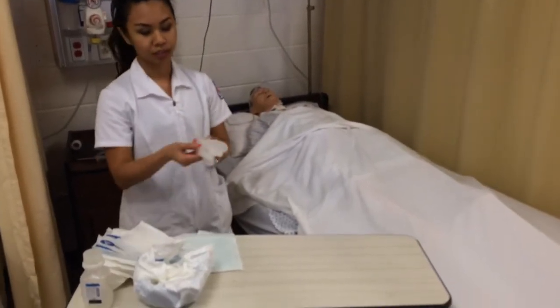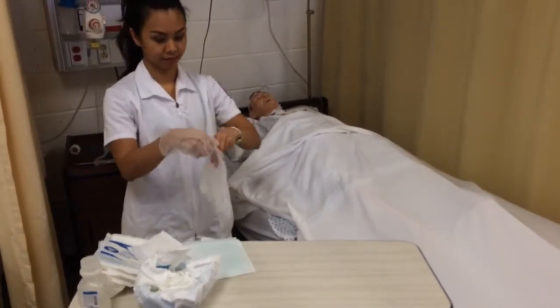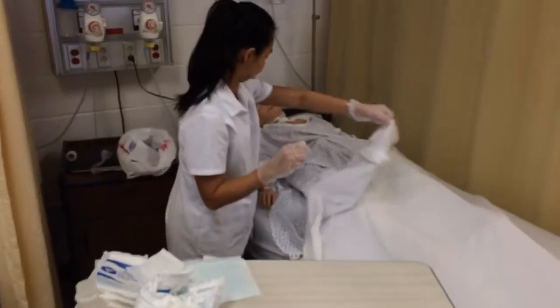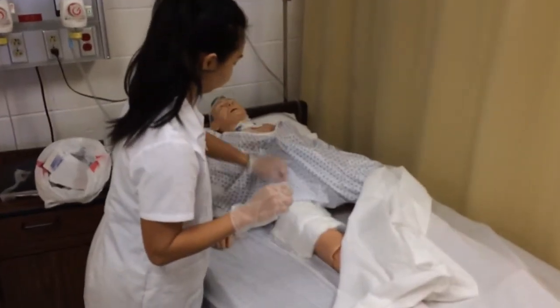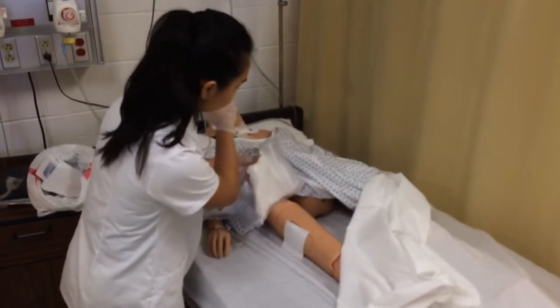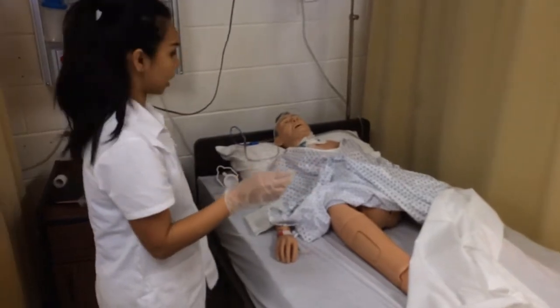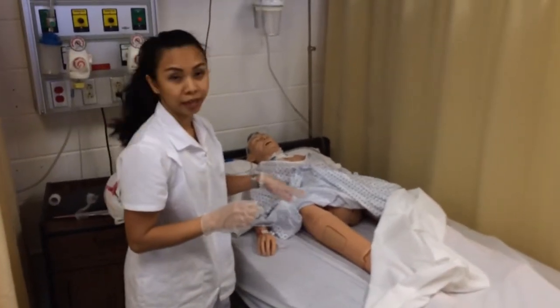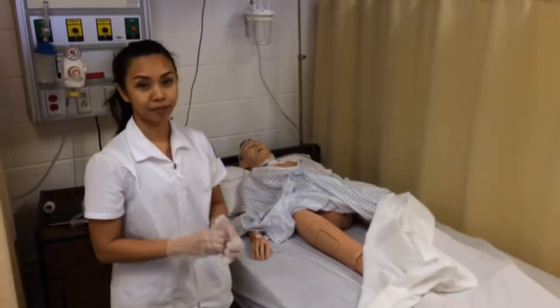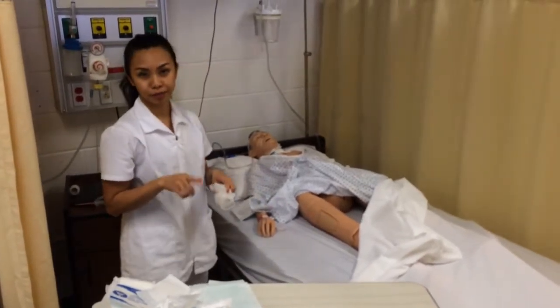I am going to use clean gloves to take the old dressing off. Then I assess the wound area for redness and drainage. After that, I take my gloves off.